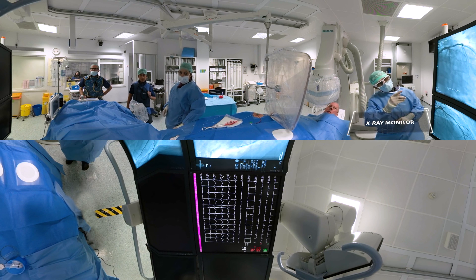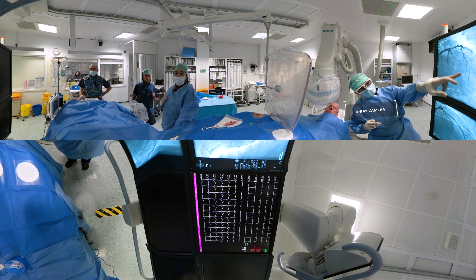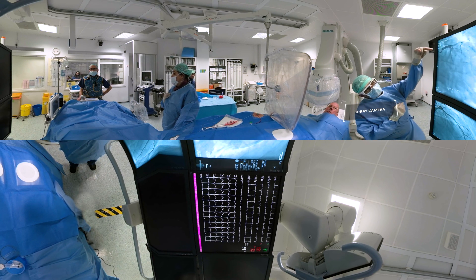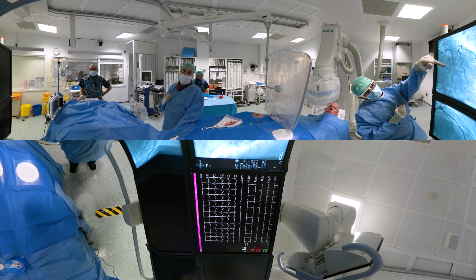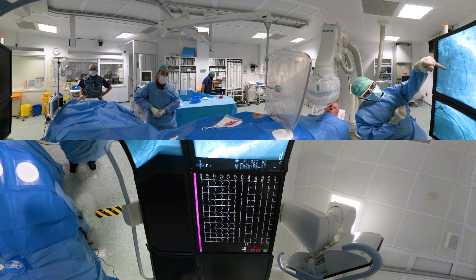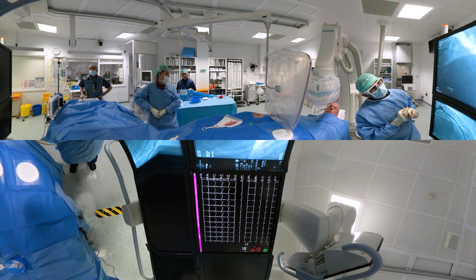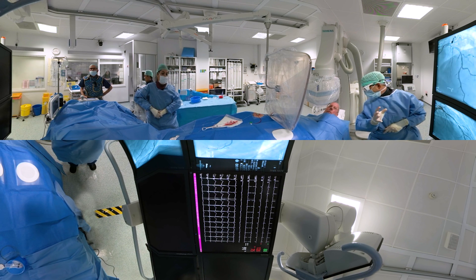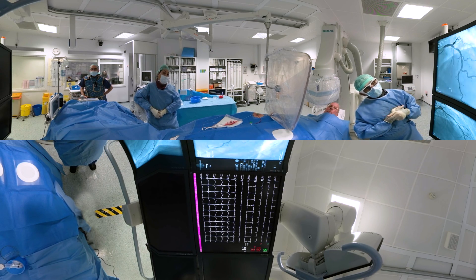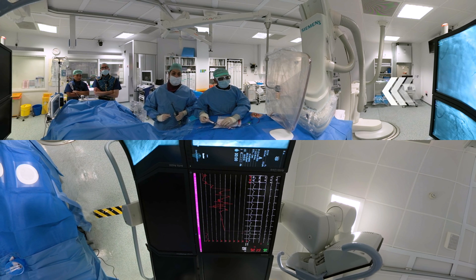This is the catheter going into the artery around the heart. The black is the dye filling up the arteries. This is the artery called the circumflex artery and it should go down further. The cause of the problem today has been that artery at the back of the heart blocking off. Because you've got pain that's ongoing, I think it's worth trying to reopen that to improve the blood supply. So we're going to start the stenting procedure.